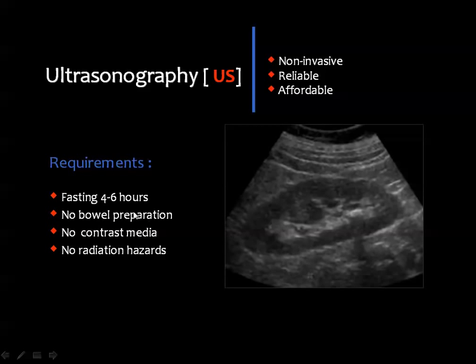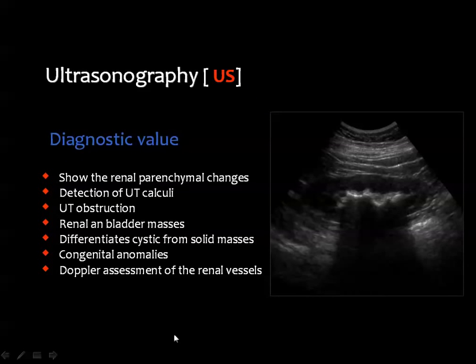Then ultrasound requires some fasting, and it may not require some bowel preparation, and it does not require the injection of contrast media, and of course there are no radiation hazards. Ultrasound is valuable in detection of the renal parenchymal changes.